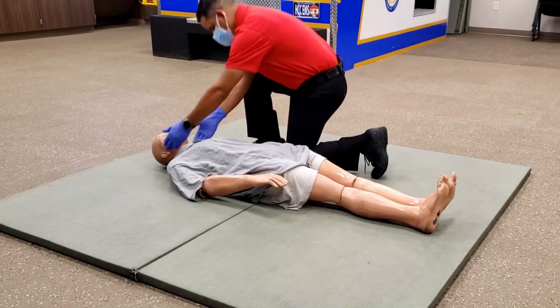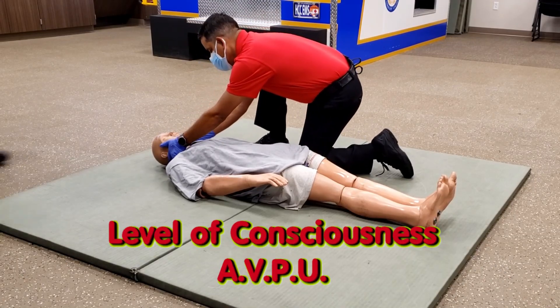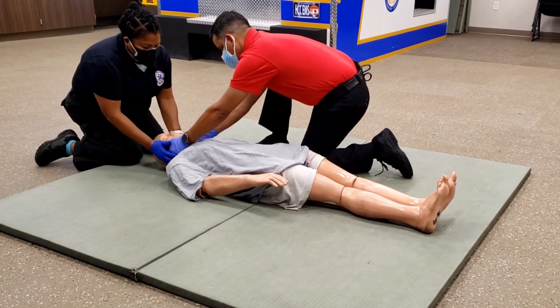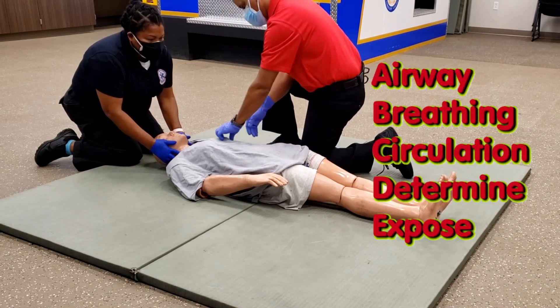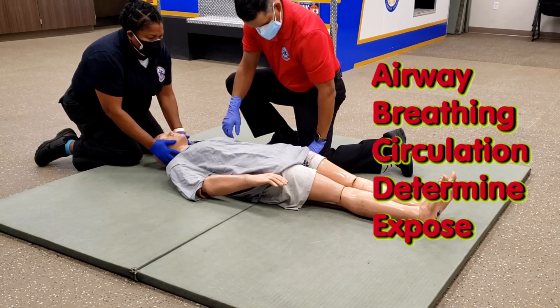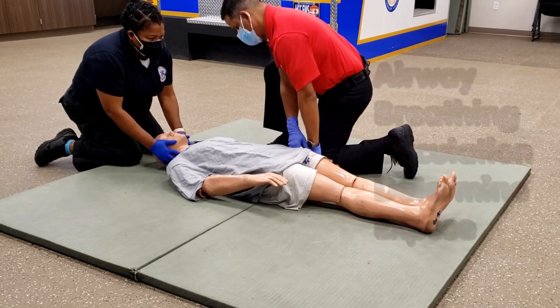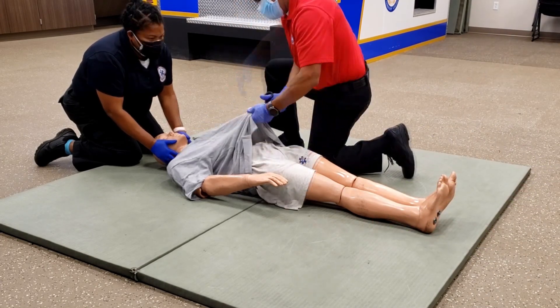Upon approach, assume manual c-spine control and assess the patient's level of consciousness. Transfer manual control to your partner and begin the primary assessment. Follow the steps of the primary assessment and physical exam as previously shown.